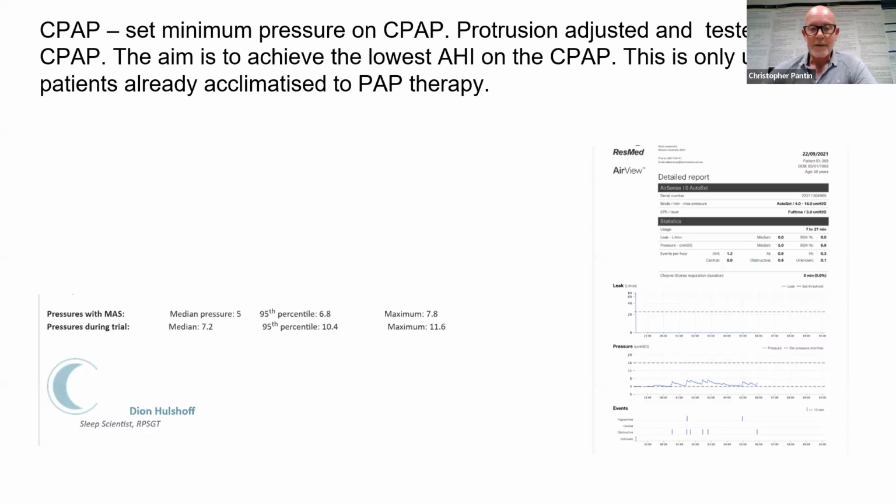So you don't have to look for moving of pressures and whatnot. There are some nuances between different CPAP machines. Some, like ResMed for instance, will overcompensate and show a big pressure change when in fact there probably didn't need to be one. So that can be a bit of a furphy. But CPAP's great because it just gives you an AHI.